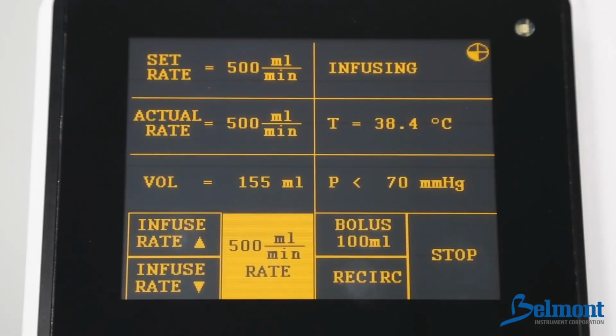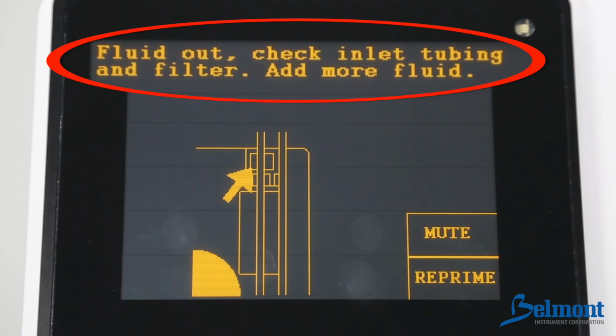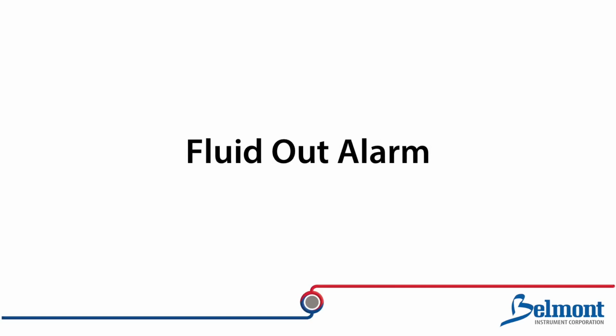The Belmont Rapid Infuser RI-2 will alert the user with an audible alarm if it senses a problem, and will display instructions for corrective measures. To silence the alarm and return to normal operation, simply follow the instructions on the display. Here are some troubleshooting tips for the alarms you might experience.